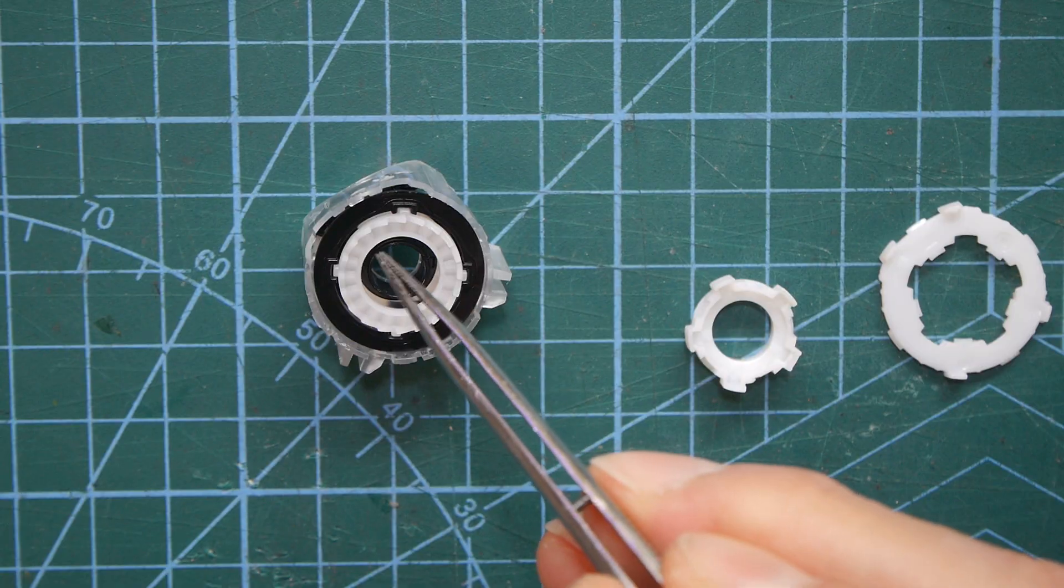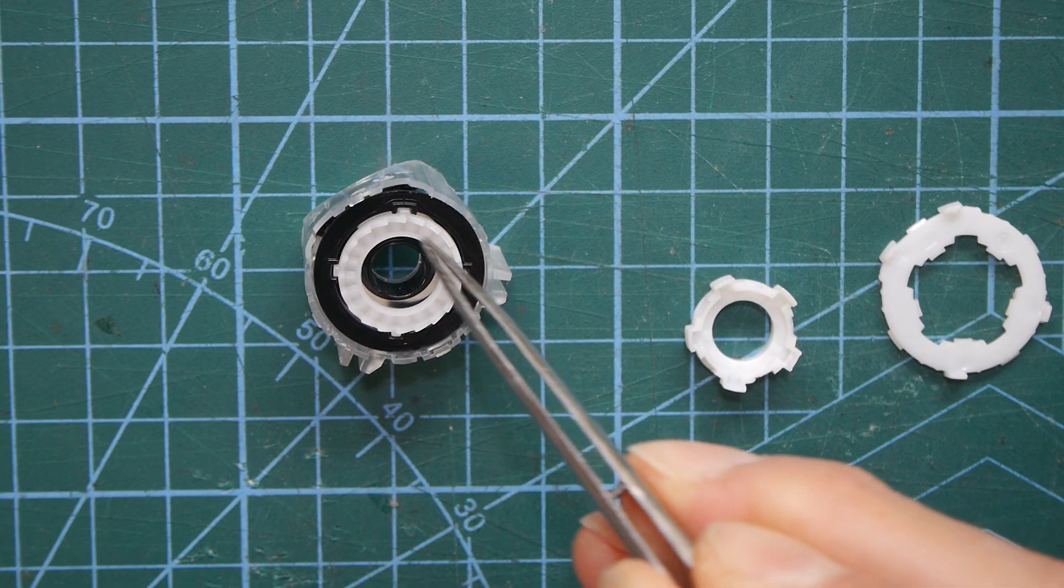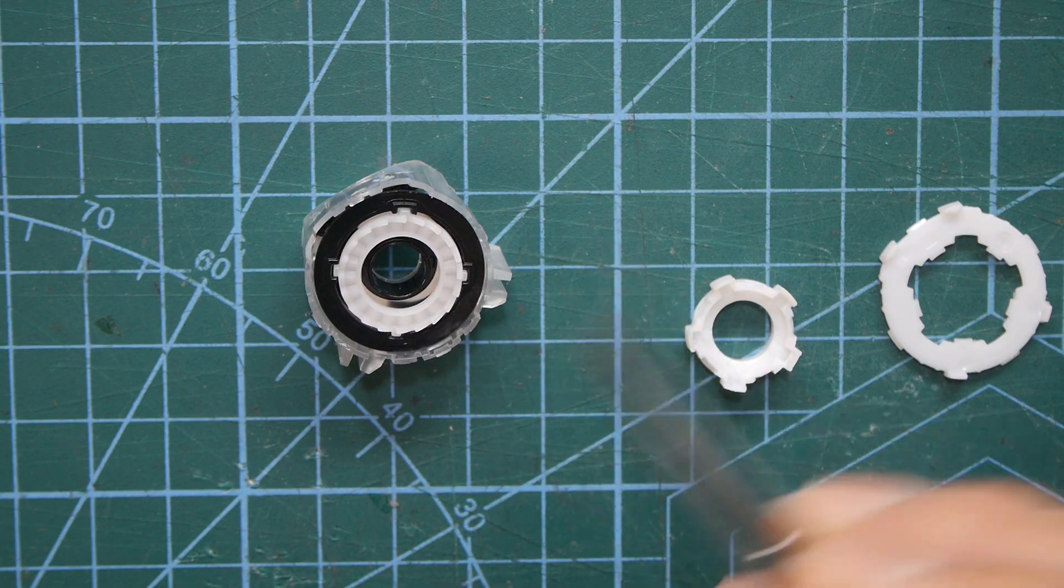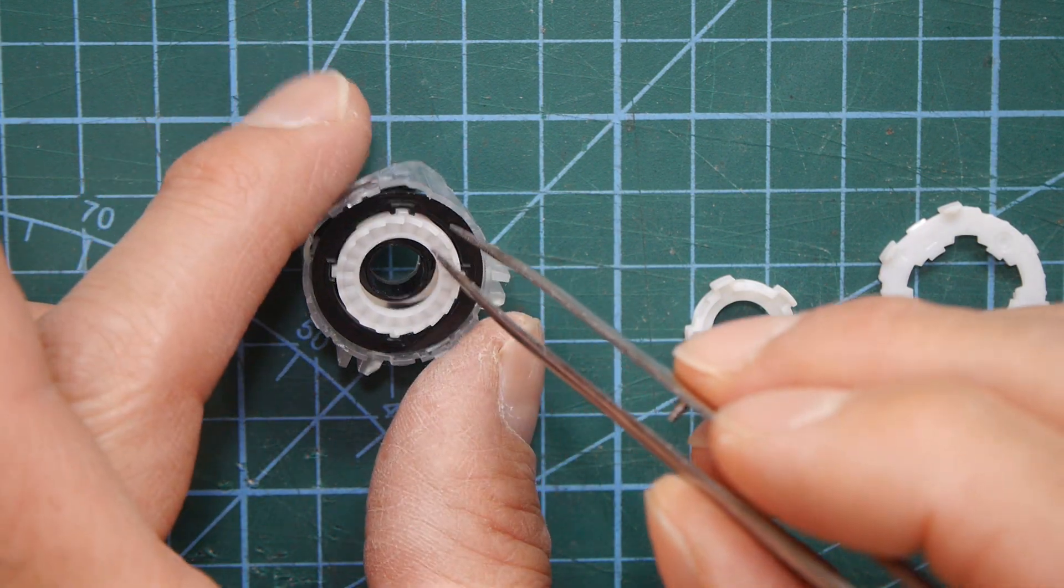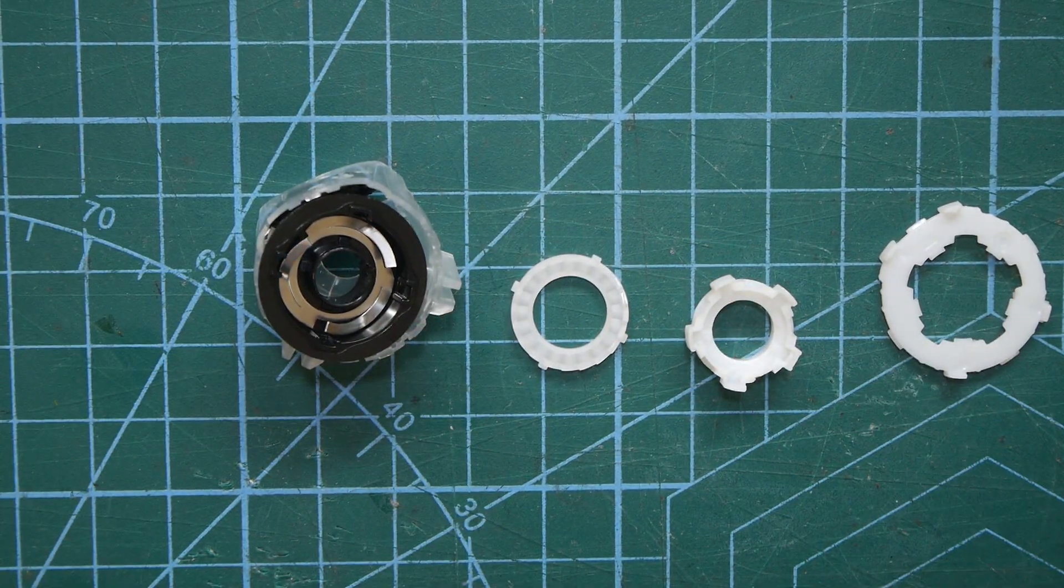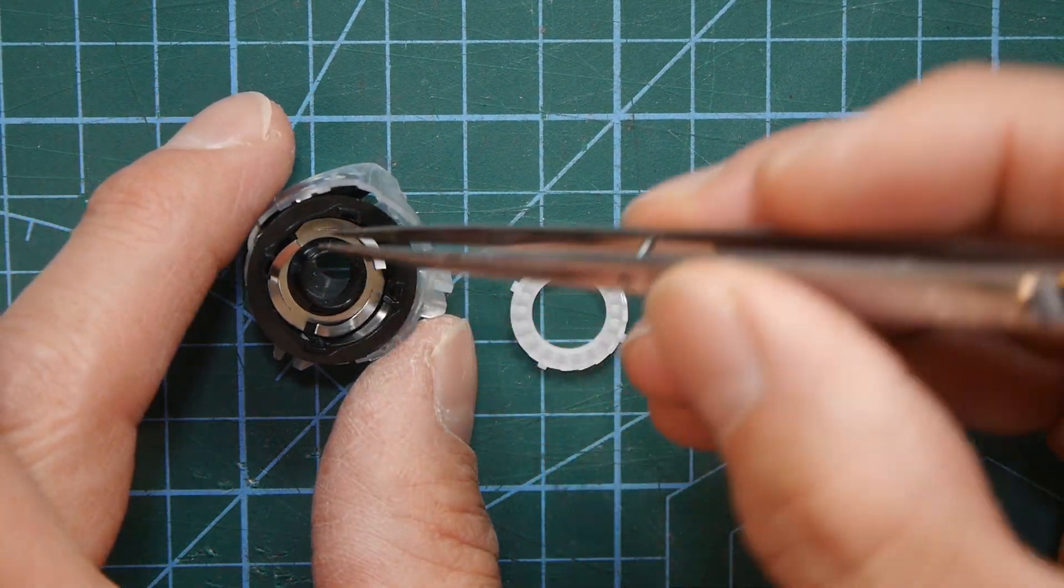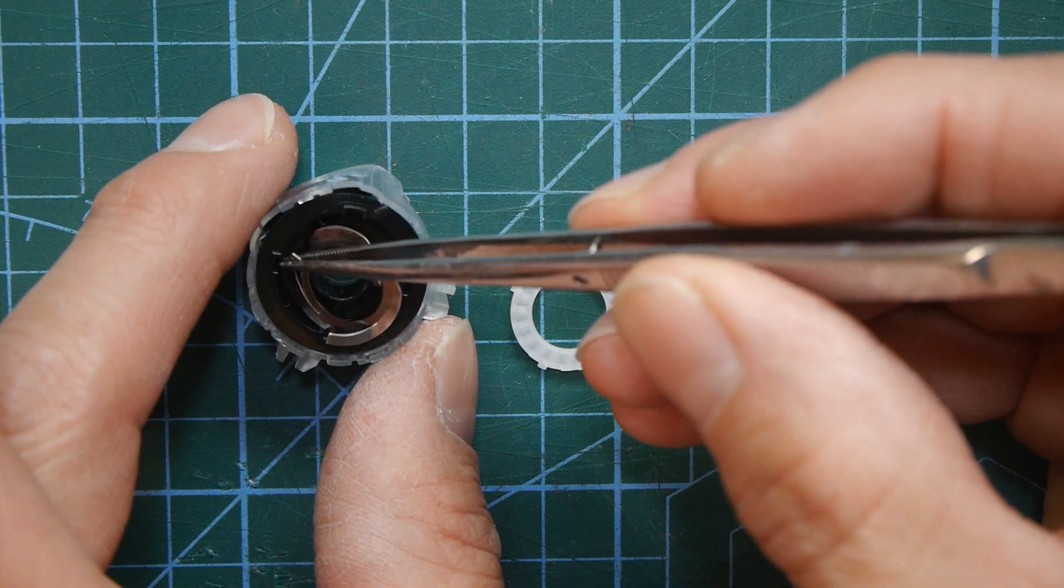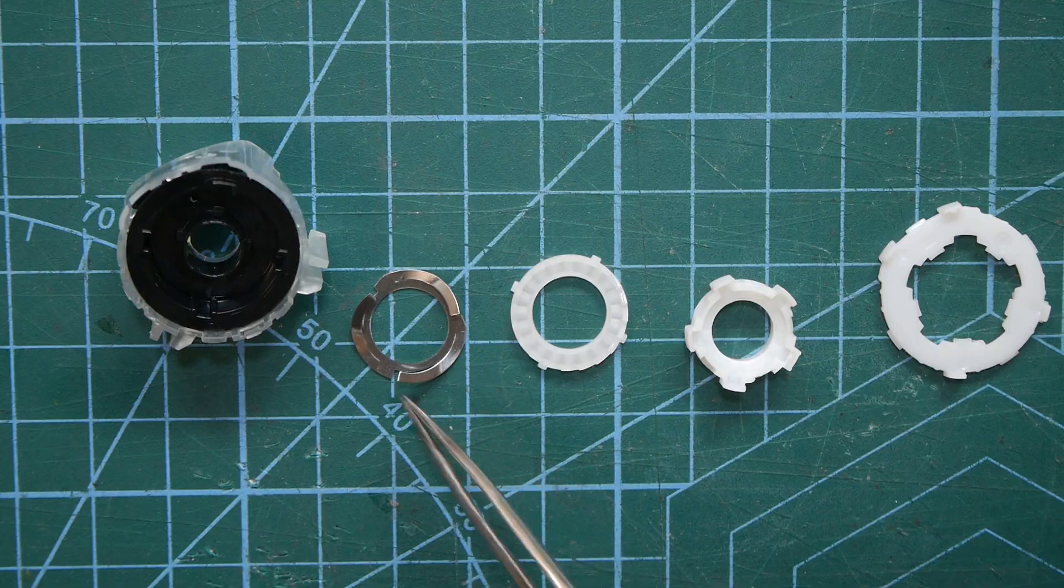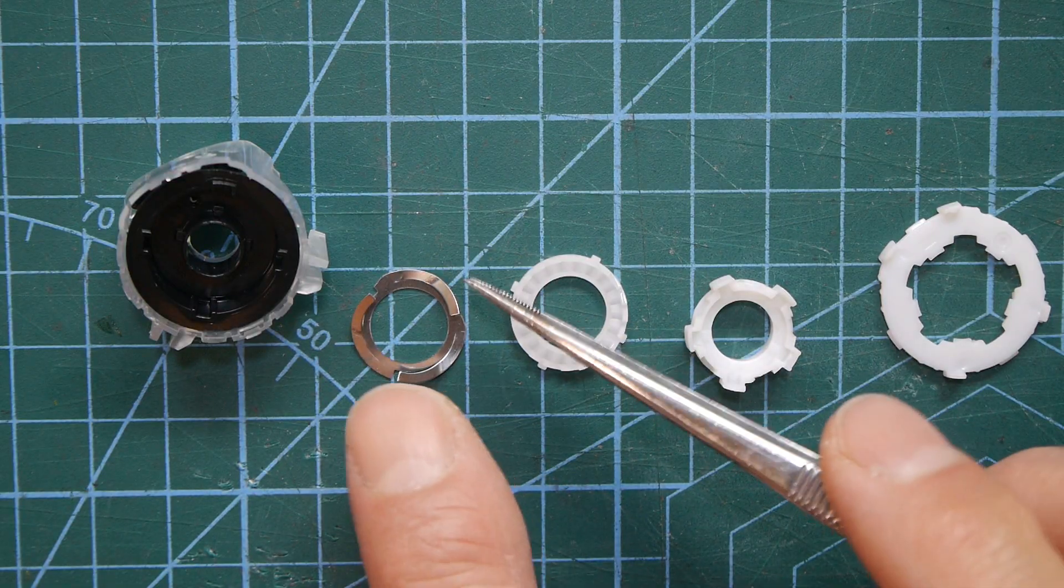And then if you look closely there's a really interesting little gear sort of ratchet system here and that's the bit that helps the counter itself rotate. So we'll take that out and then underneath that there's a spring.